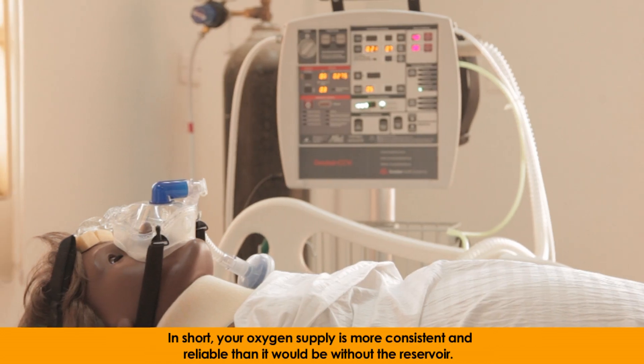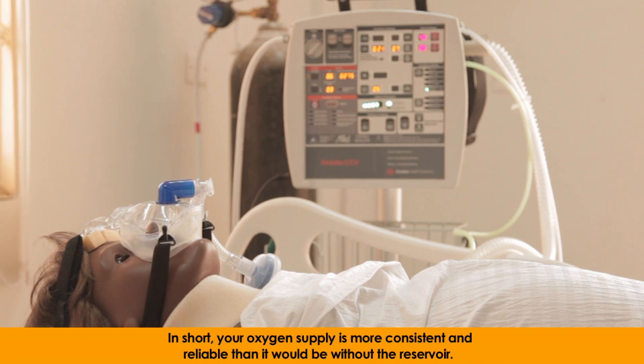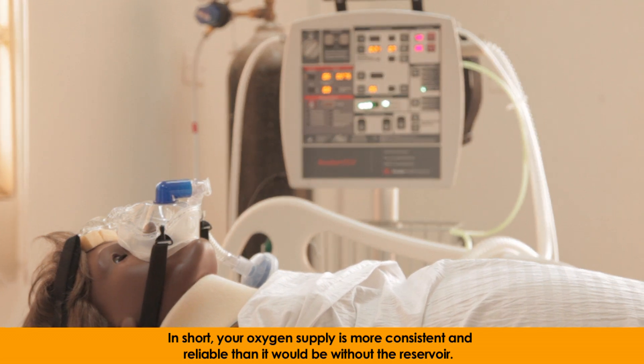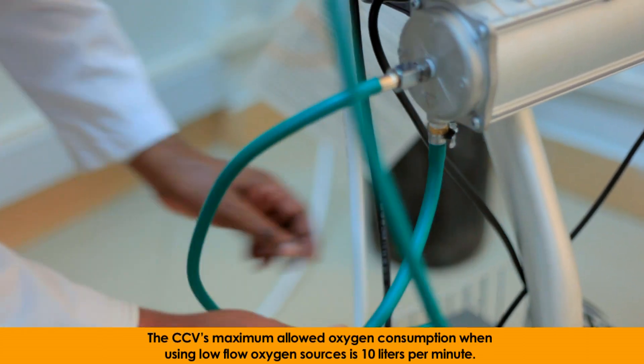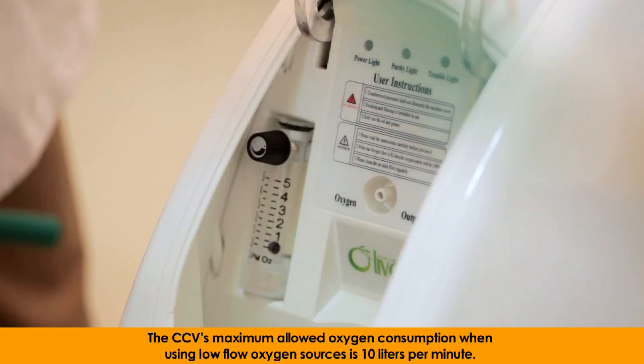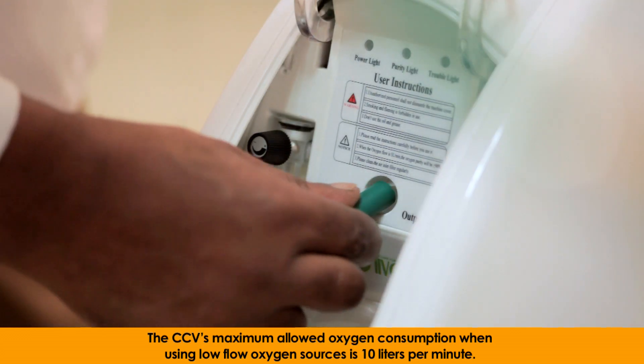In short, your oxygen supply is more consistent and reliable than it would be without the reservoir. The CCV's maximum allowed oxygen consumption when using low-flow oxygen sources is 10 liters per minute.